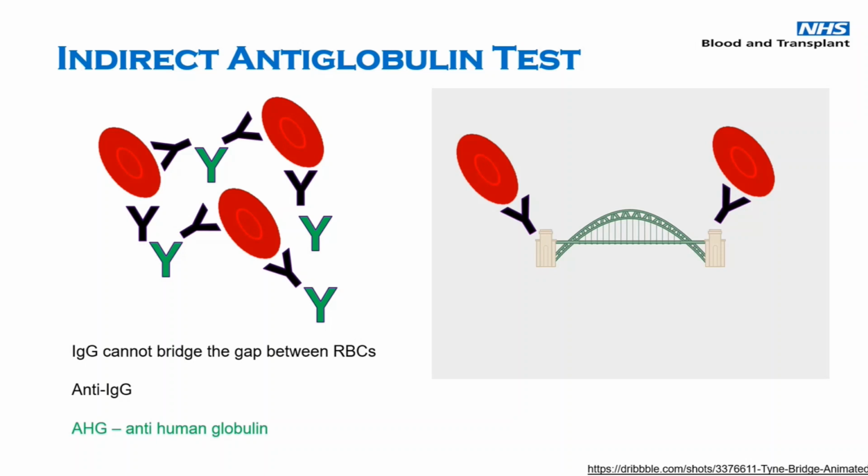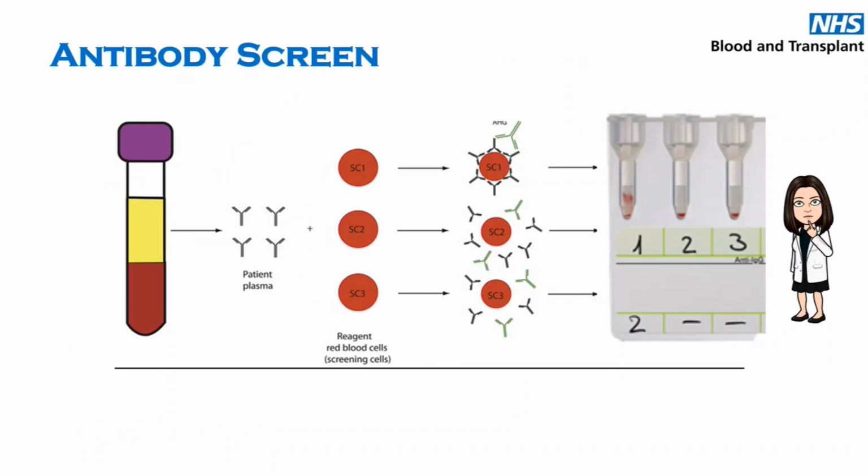We call it green stuff. Past the green stuff, or the cards are already green. So just a little bit of background there for you. So go back to our antibody screen.